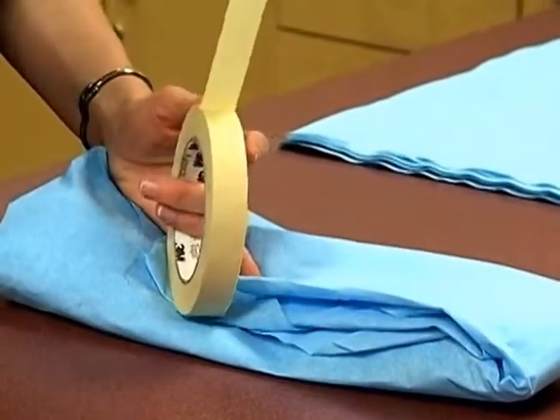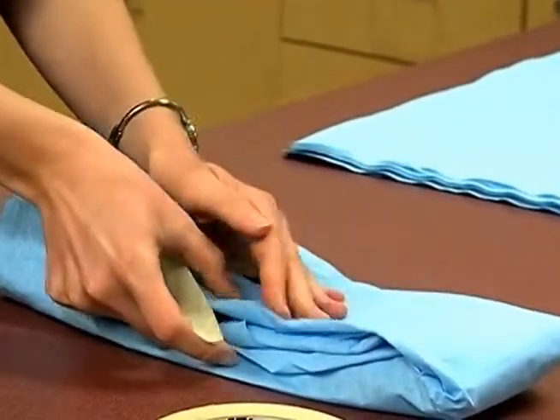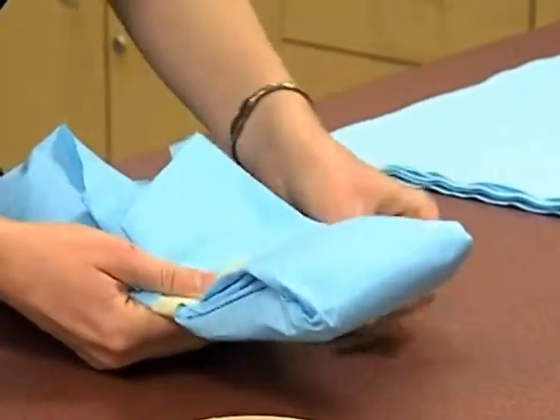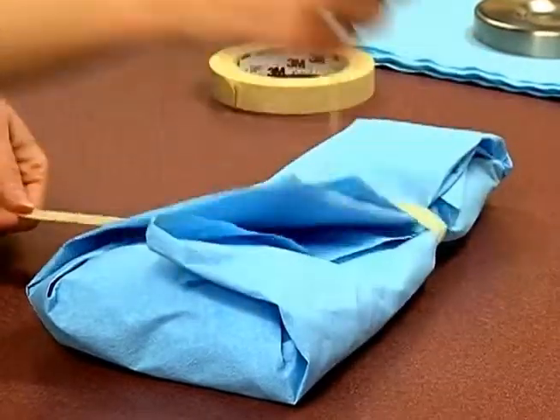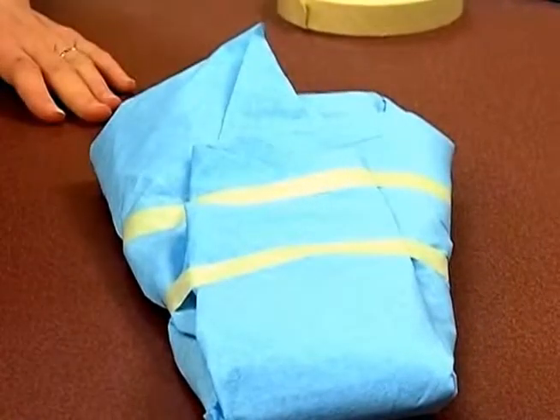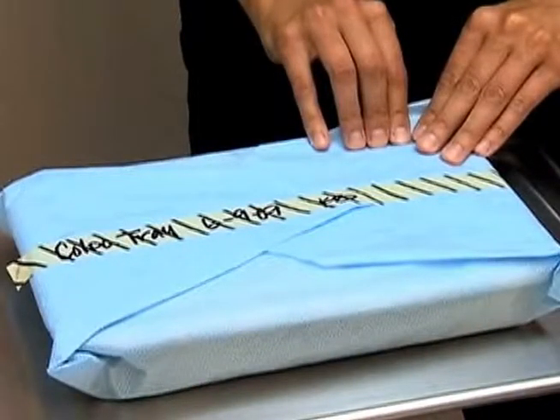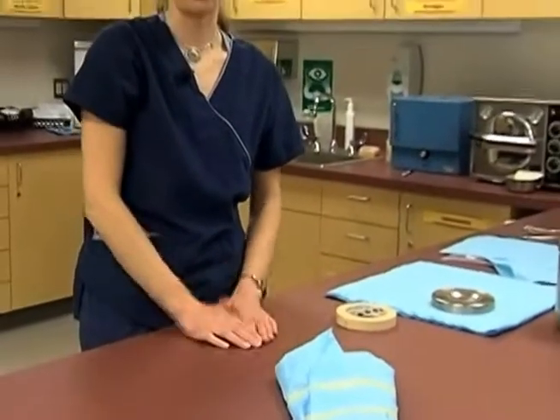The tape we use to close up our pack is very specific — this is autoclave tape. It can handle the temperatures we're going to put it through in the autoclave, and it also has an indicator built into the tape. I usually like to make a little fold at the end of the longer piece of tape so that it's easy to open. After this tape has gone through the autoclave, it will develop black stripes along the outside if the autoclave reached the proper temperature. This way we know the outer part of the package reached the proper temperature, and our indicator strip on the inside tells us it also got that hot on the inside as well.